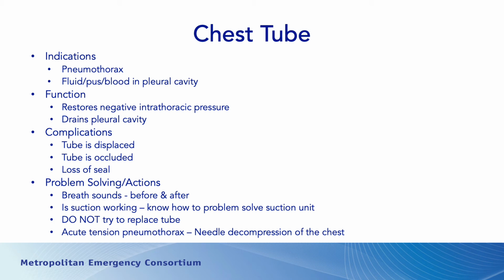What do you do as an EMS provider? Well, if you're transporting a patient with a chest tube, I would suggest you listen to the breath sounds on both sides before you transport to make sure they're equal. If there's any change in the patient's status, listen again. Are the breath sounds still equal? Think about, is the suction working? So know how to problem solve the suction unit that's in place in the chest tube setup, and I'm going to talk about it on the next slide.